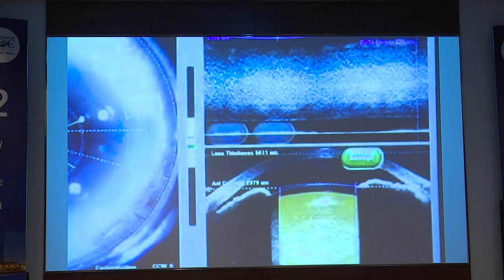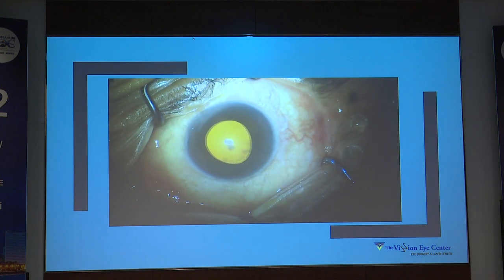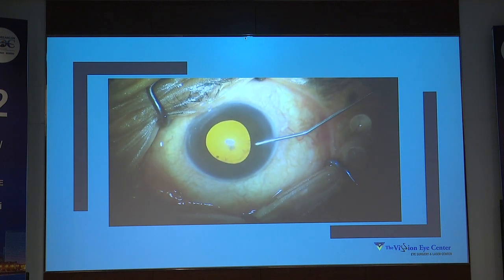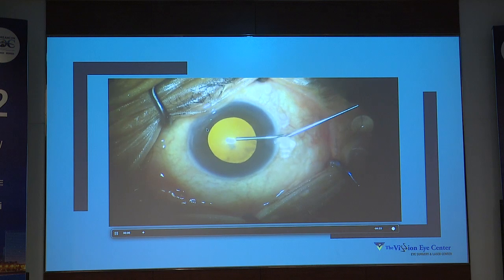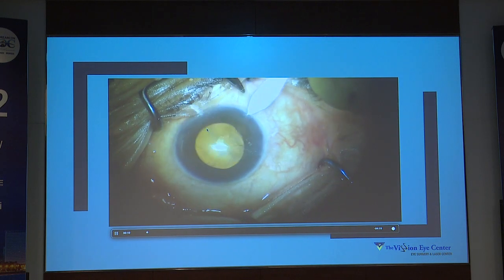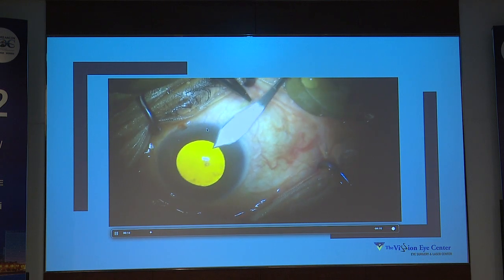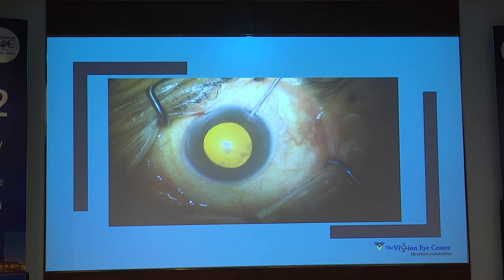Once your incision is there, I'm trying to take a deeper incision so that the iris does not prolapse. It is important even for the side port that you go through a little longer distance so that the iris doesn't walk out with you when the fluidics start.